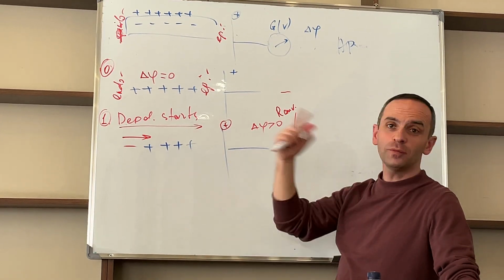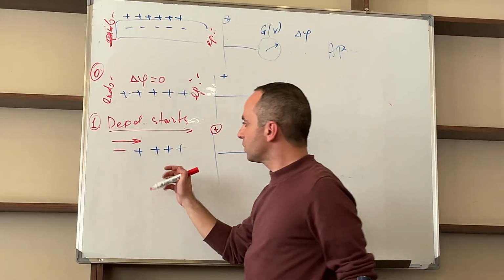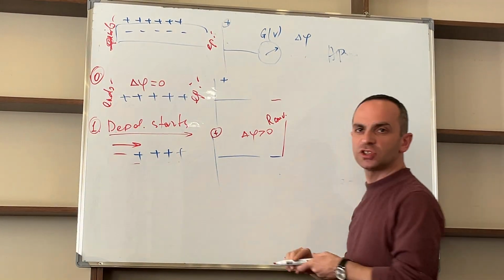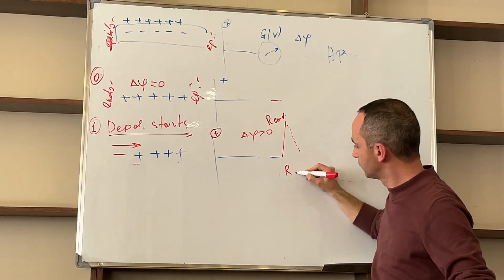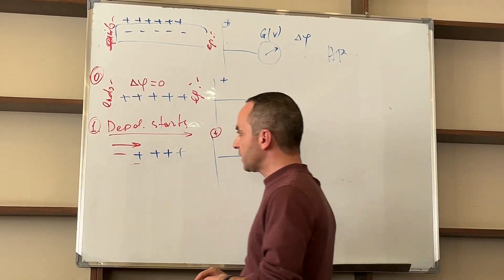If we have it in the whole myocardium, it will be called R. Then it is becoming minus, and it reaches its peak, then comes back by those lines. This is the conventional R wave.